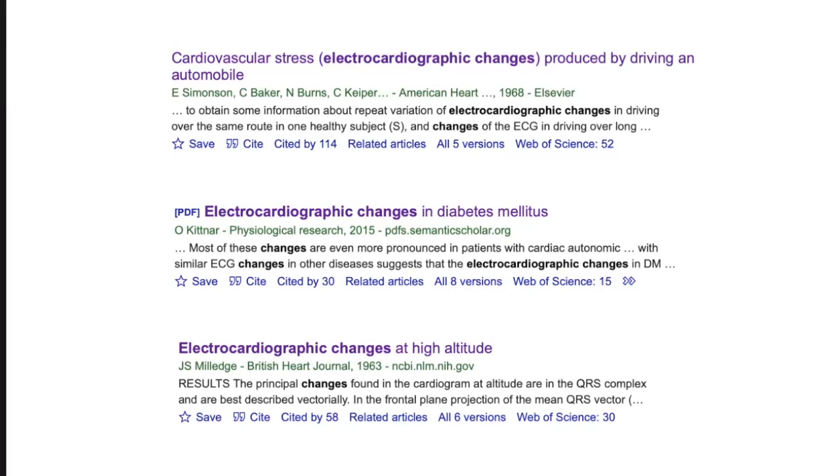So don't be distracted by the words. Just recognize that there is this fundamental problem that a lot of medicine has. If you see two halves of somebody's finger poking out, it's pretty clear they've broken their finger. There is some easy diagnostics like that. But a lot of the time it's a lot more complicated. And the ECG, while it's very cool how you can make these relationships, like I have a block here in my Purkinje network and it causes this change in the ECG, it is cool that there is that very clear relationship. But we have to be careful how we use it in the diagnostic direction.